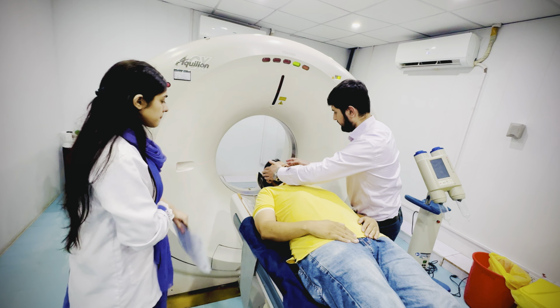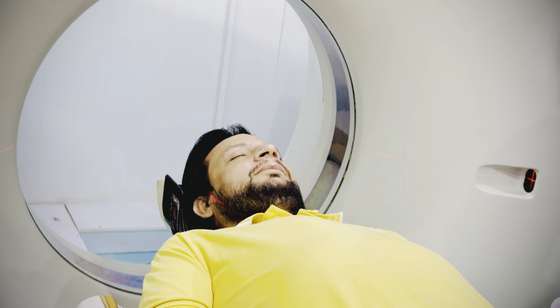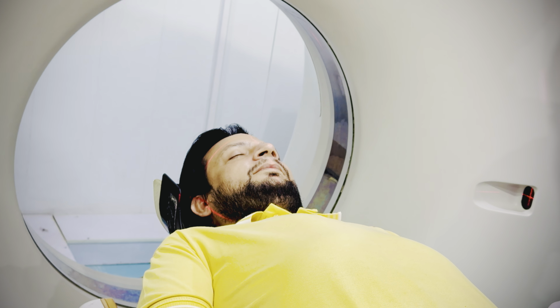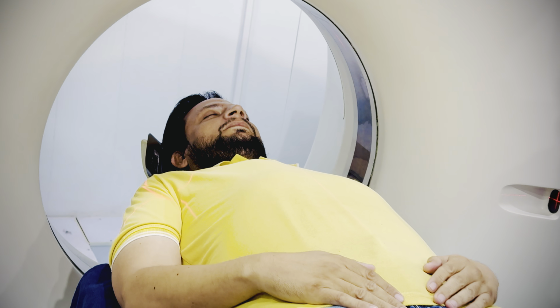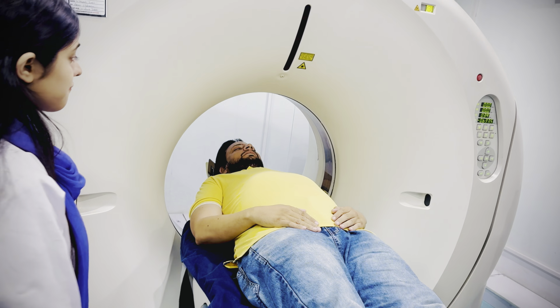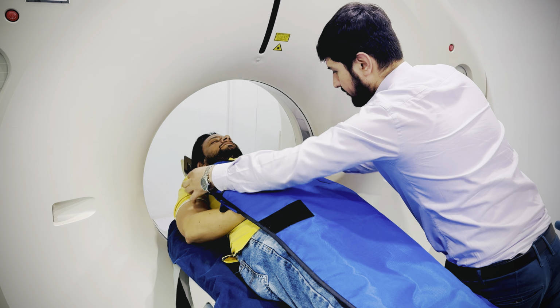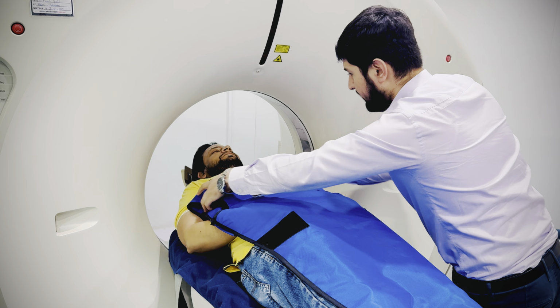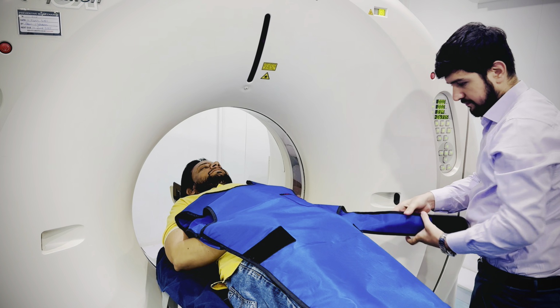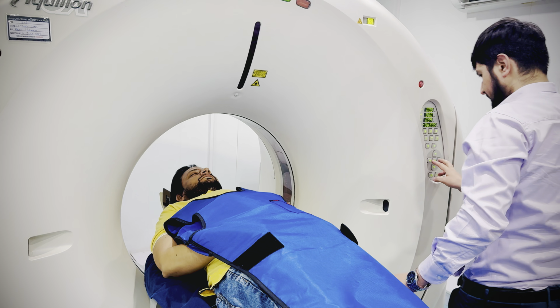Align the canthomeatal line, also known as the OM line, horizontally from the outer canthus of the eye to the external auditory meatus. Center the head midline of the patient to the scanner with the help of the localizer lights of the CT scan. Place a lead apron onto the patient to minimize radiation exposure to body parts that are not being scanned. These are worn to protect radiation-sensitive organs.